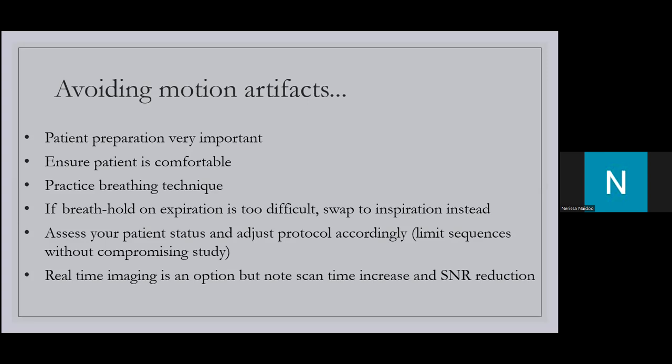Sometimes, though, some patients find it very difficult to hold their breath on expiration. If that is too difficult and you can see that your patient really isn't going to manage this, I would swap to inspiration instead. You'll find it's a more natural way to hold your breath. And if it's not going to affect your images too much, or you're actually getting better image quality than on expiration, then go on to inspiration. It really makes a difference.